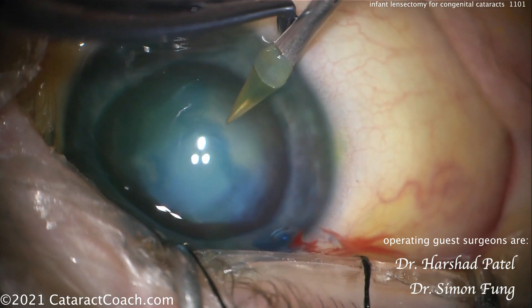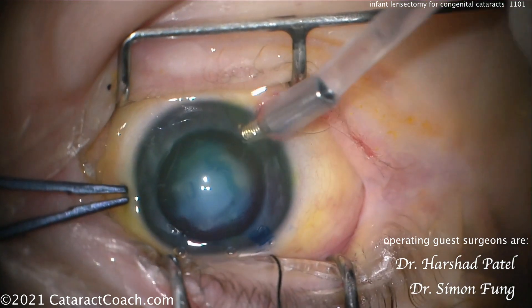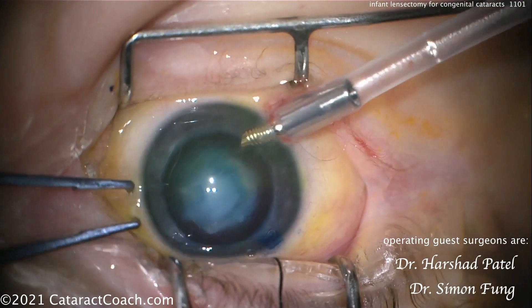Here's the second incision. Again, looks like using an MVR style blade right at the limbus, barely nicking the limbal vessels. That goes in very nicely.